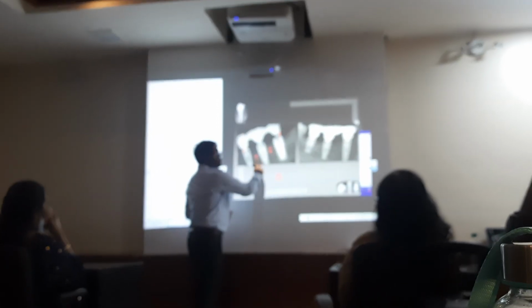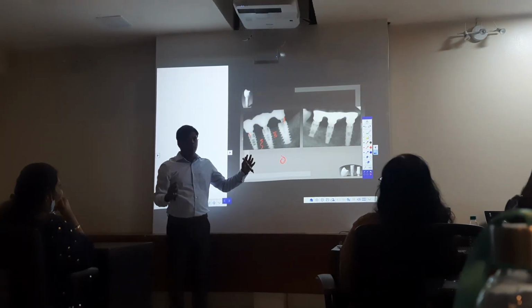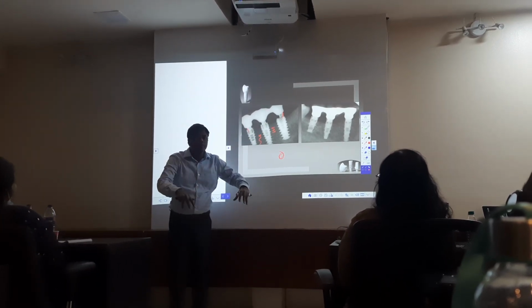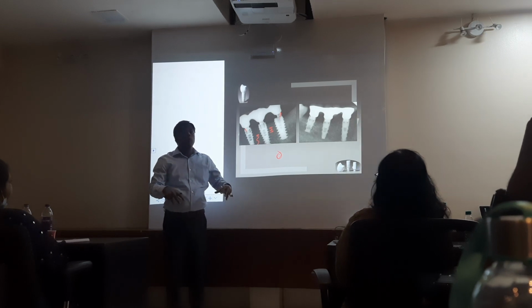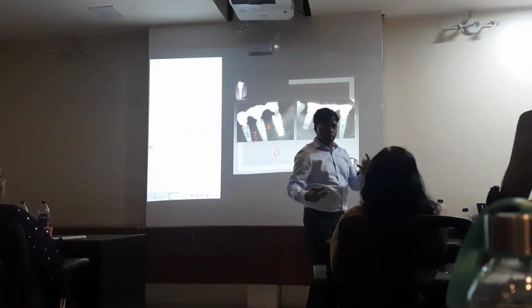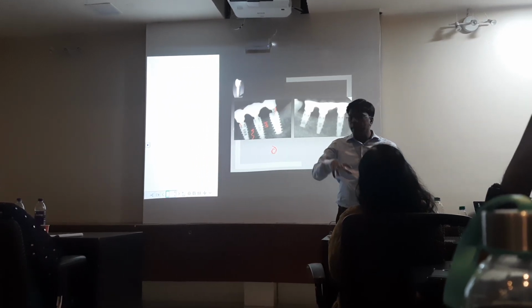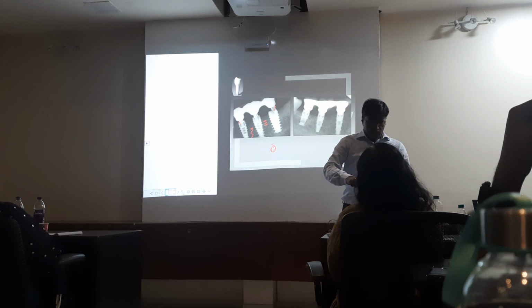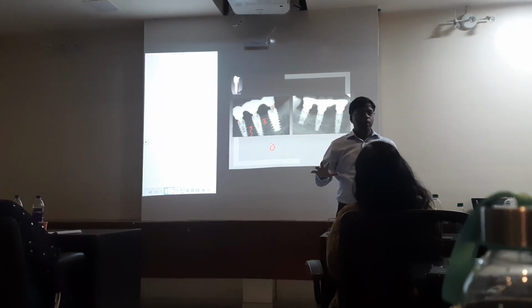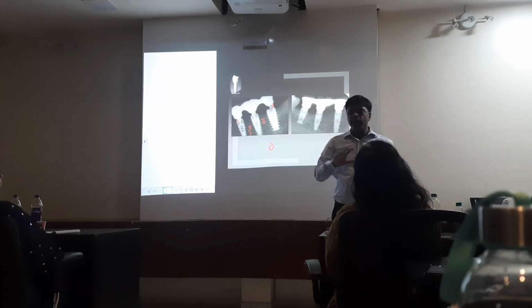Bone is resilient. It is not a stone or a granite, it is resilient. So slightly it can move and actively you can see it. But what happens? The same active pressure reaction. Okay, so it can loosen. So any crown, proper fit means quarter turn you should get. But if there is any interference, when will you get interference?